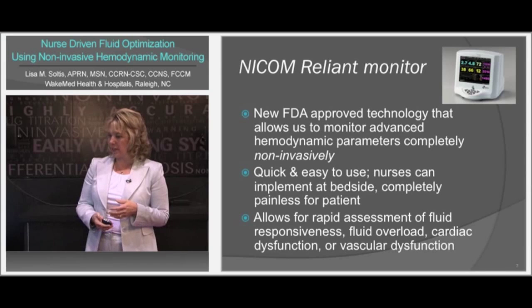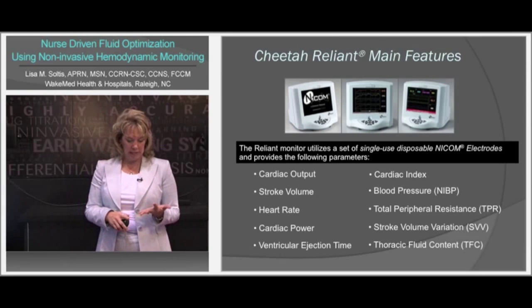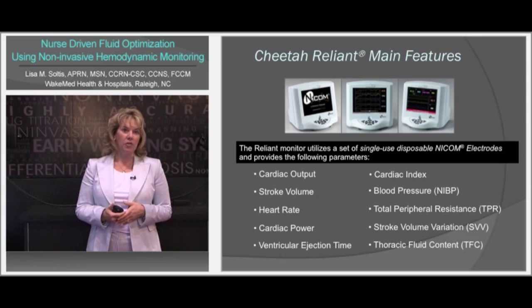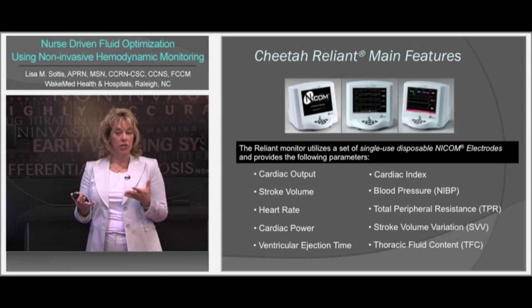The monitor itself gives us our cardiac output, and also gives us our cardiac index, which we all know is a better indicator of the overall cardiac function and how well their cardiovascular system is able to sustain perfusion through the body itself.